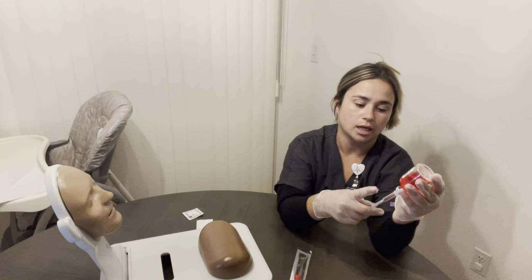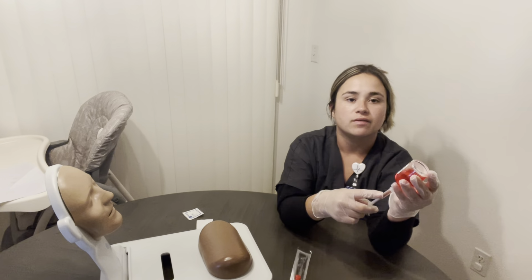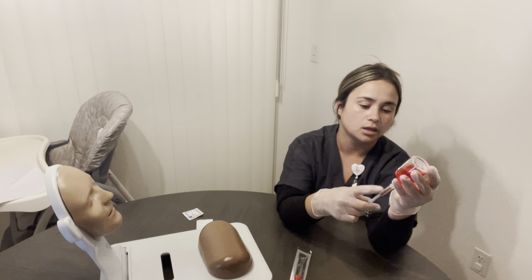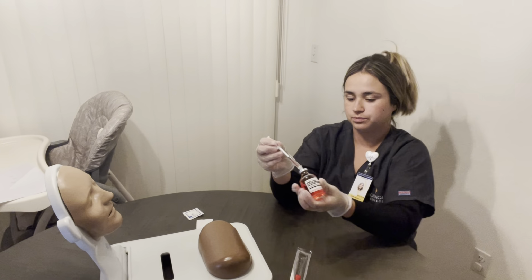Okay. Now we're going to go ahead and tap just to make sure there's no air bubbles. If there were, we could push the medication back into the vial. And if there was a lot, then I would redo this whole step just to make sure that there was no bubbles. Okay.